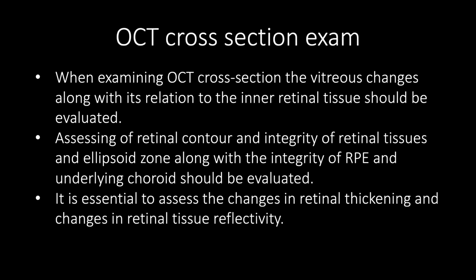It is essential to assess changes in retinal thickening and changes in retinal tissue reflectivity.